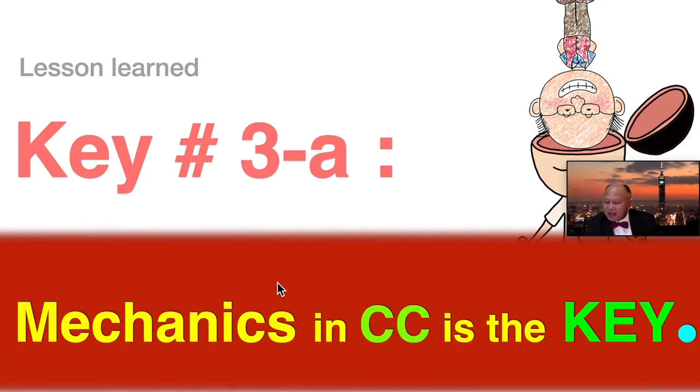Mechanic in clear aligner is the key. When you write a clear aligner prescription, if you have the right diagnosis and reasonable treatment, the next step is to think about mechanic. What kind of mechanic will drive the teeth to the position you want, in a fashion and at a speed that is reasonable? That needs experience. And do you really think that technician has that kind of experience?